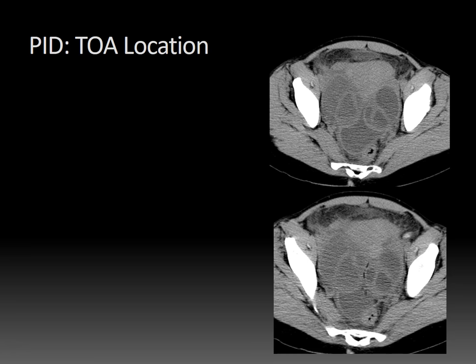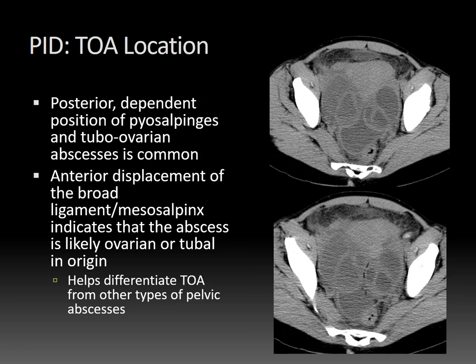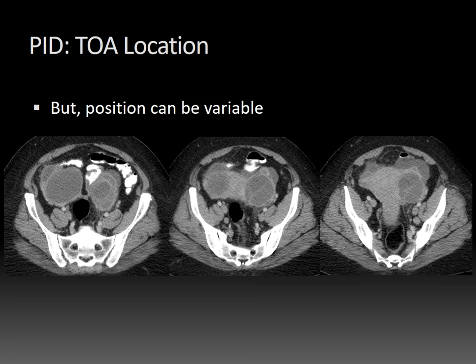A note about tubovarian complex location: posterior-dependent position of the pyosalpinges and tubovarian abscesses is common. Associated anterior displacement of the broad ligament mesosalpinx indicates the abscess is likely ovarian or tubal in origin. The portion of the broad ligament that forms the mesentery of the fallopian tube is the mesosalpinx, and here you can see it displaced anteriorly by these posterior bilateral tubovarian abscesses. This will help you differentiate TOA from other types of pelvic abscesses. Note also the extensive anterior pelvic fat stranding, classic for pelvic inflammatory disease.